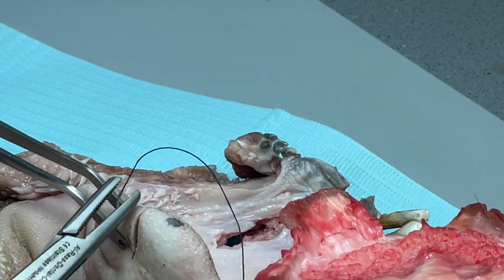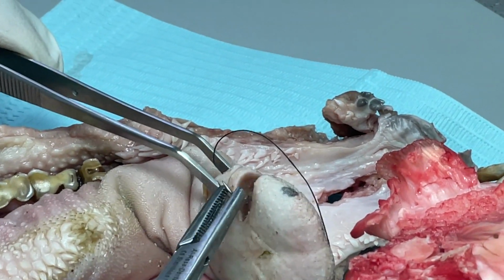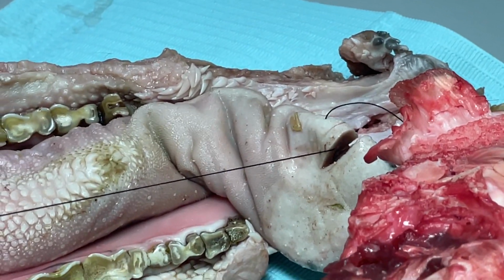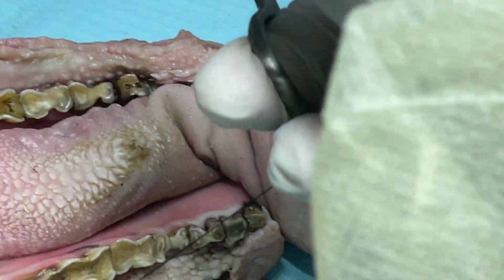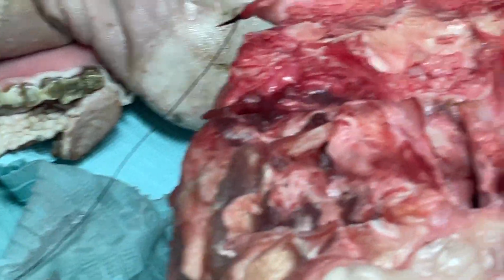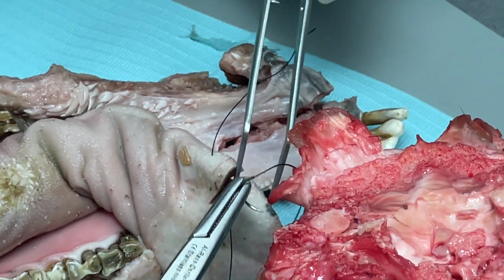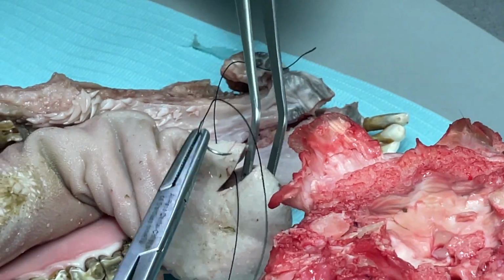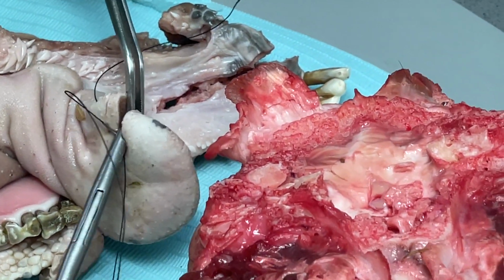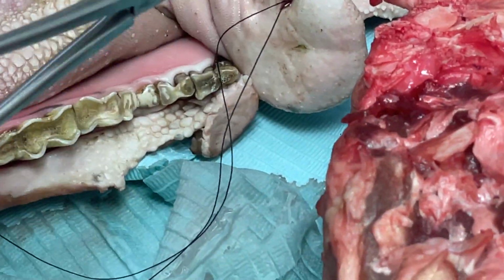Actually, in this case, we'll need a longer needle, but I'll try to show it to you with this. Okay, so I got a deeper bite. Again, deeper bite on the internal side of the other one. Correct? Yes. It should be almost similar distance, but let us see if we can get it or not. It should be shallow, wide. Deeper bite first, both are deeper bites.